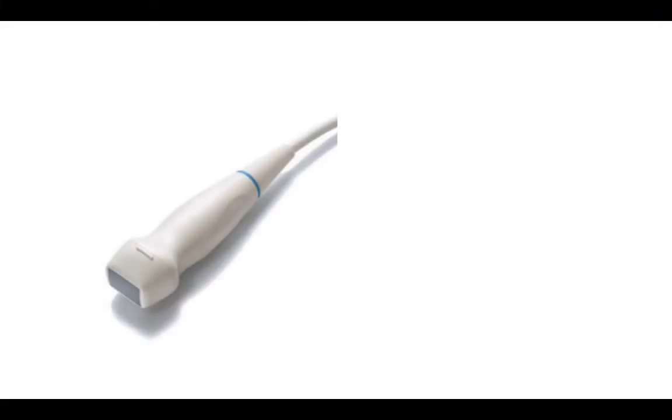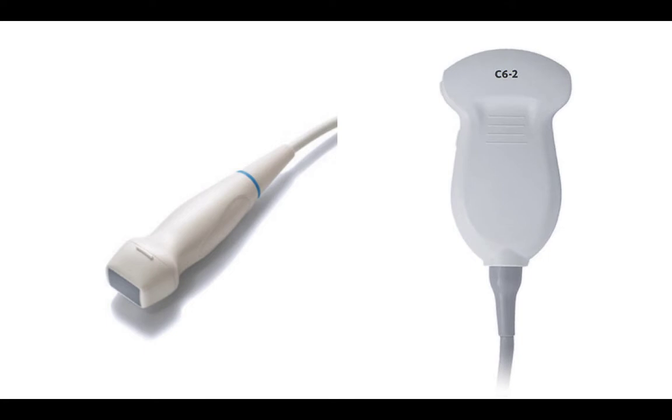So to do a lung ultrasound, the probe of choice is going to be the cardiac or the abdominal probe. I actually like the abdominal probe more when assessing someone's lungs because it has a wider footprint and it allows you to look at more than one space at a time. It also gets to the appropriate depth, and we'll talk about that in a little bit.